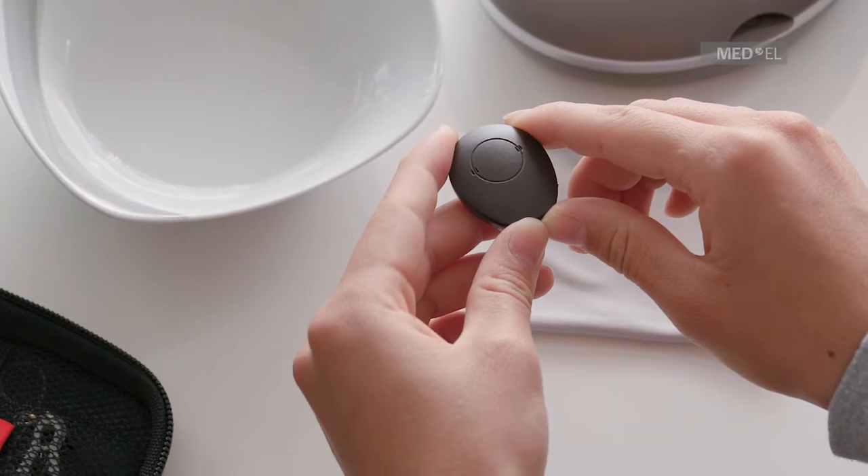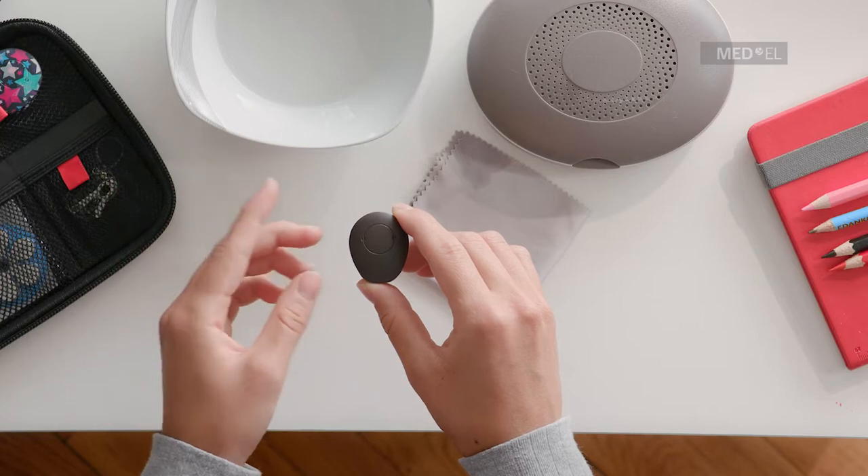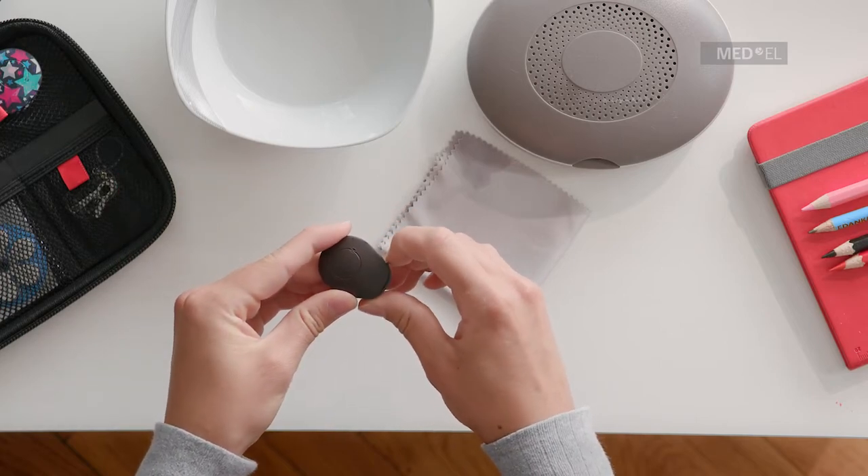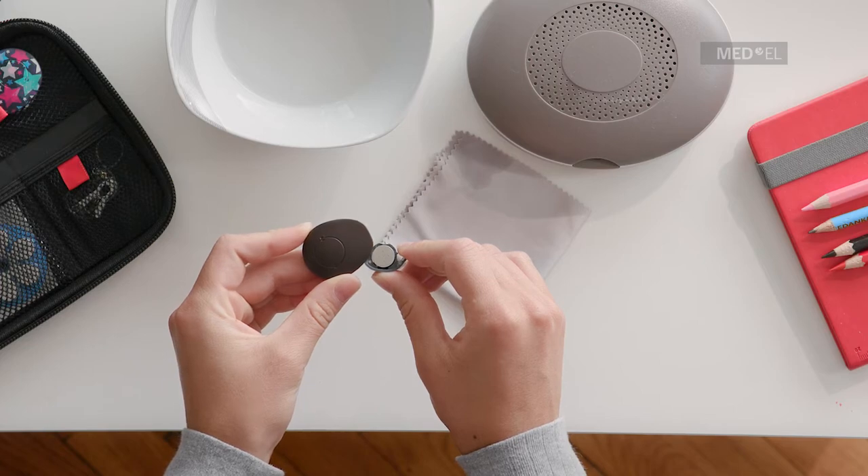Do not use aggressive cleaning agents. When not in use, Samba 2 should be kept in the case provided. To extend the battery life, you can remove the battery from Samba 2 or simply open the battery compartment when not in use.